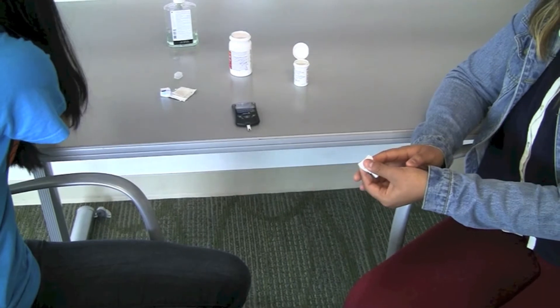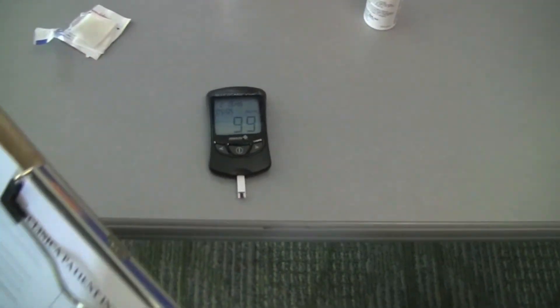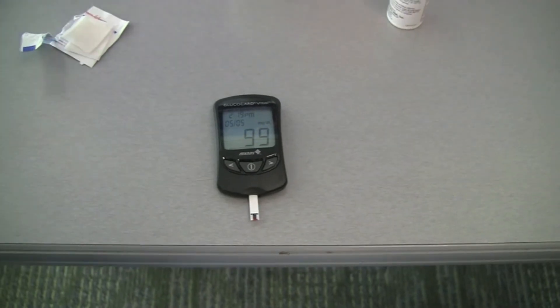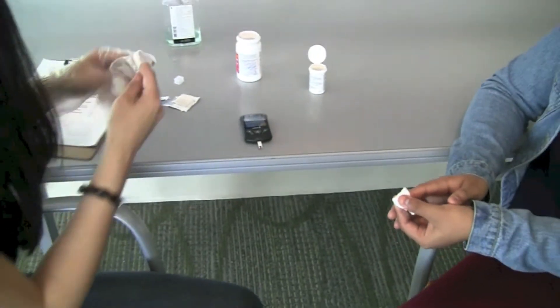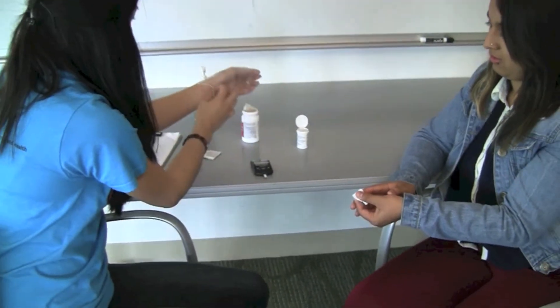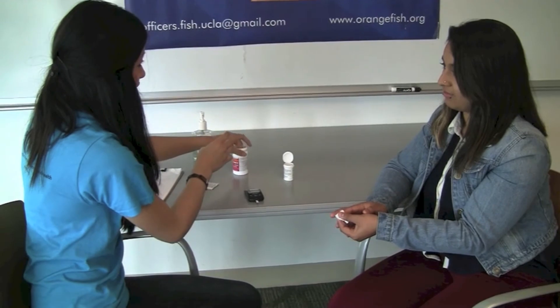Wait for the machine to give a reading and record the number on the patient's clinic sheet. Take off gloves and dispose of them in the sharps container. When finished with the procedure, ask if the patient is okay, thank them, and send them to the consultation section.